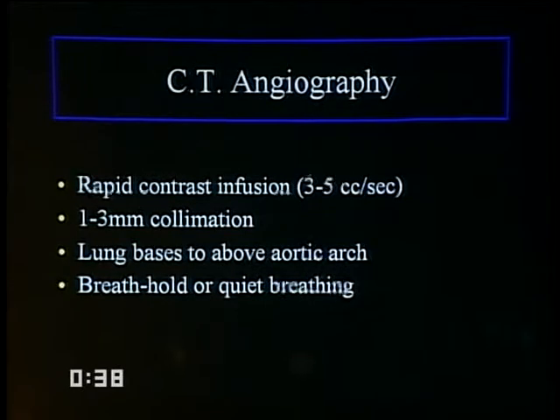We had used 3 cc's per second for many years, but have increased to 4 cc's and find that we haven't really any significantly increased extravasation and do have better opacification. I think that's probably the most common injection rate to use, approximately 120 to 150 cc's. Very important, the injection continues throughout the scan. The moment the forward pressure ceases, the opacification will tend to drop.